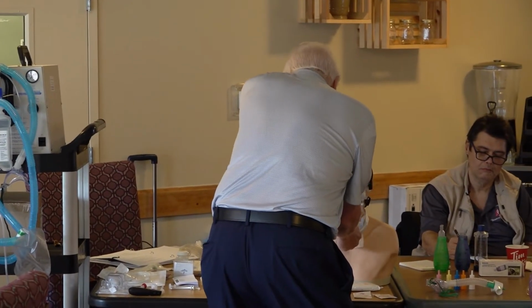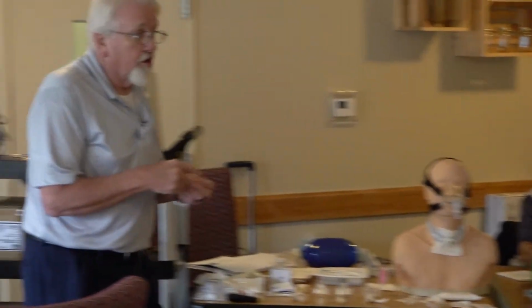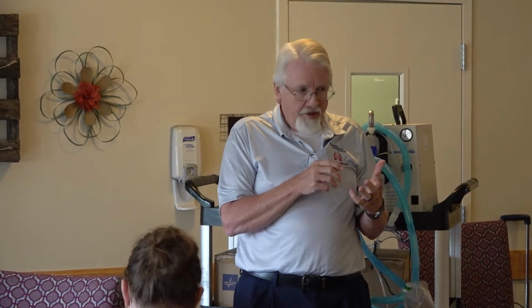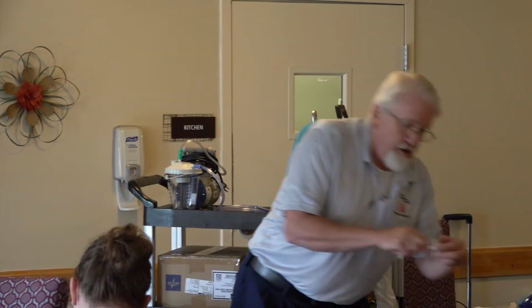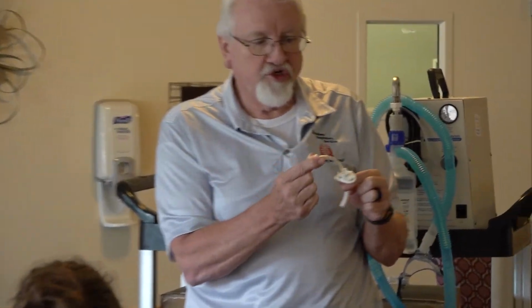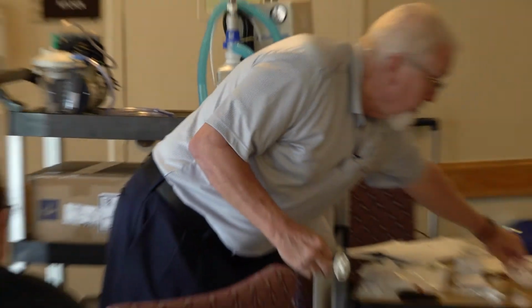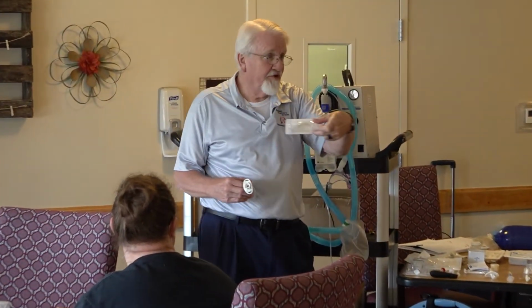Usually when a facility gets that type in, they'll call, or well, you guys will have an RT, so you won't have to call. We'll get that changed over to the disposable inner cannula type, so that when you come in to do the Trach Care, you just pull that out and throw it away. And then you're going to have a new one in a pack that you're going to take out and put in there when you get done.